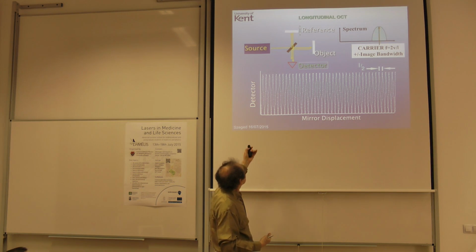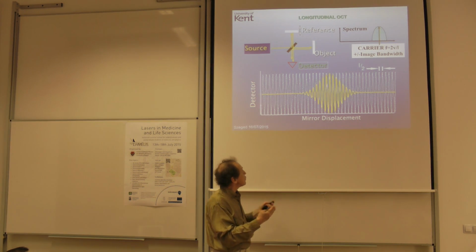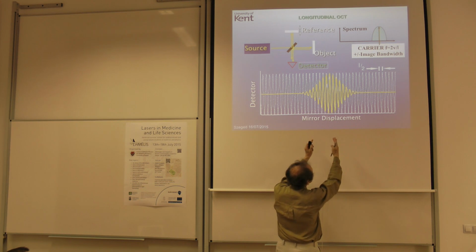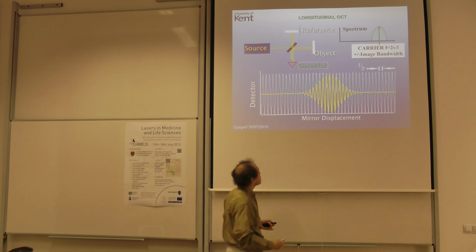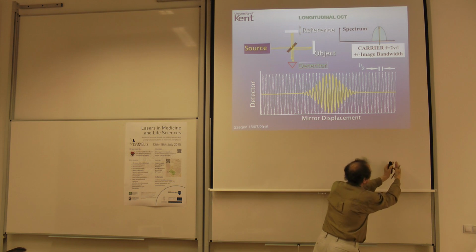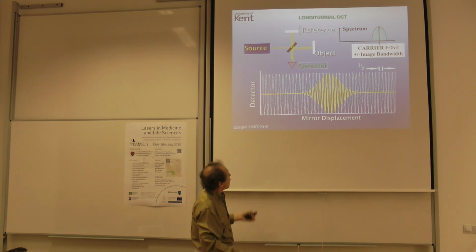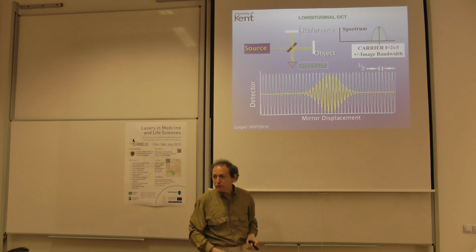So what I need is to replace the laser with a low coherence source, i.e. with a source having a broad bandwidth. And in that case, it is the wave train length which limits the number of peaks here. So now we can practically evaluate the axial resolution of the method. If you do the Fourier transformation of that broad band, you will find that narrow correlation peak, and that corresponds to the extension of this yellow fringe pattern. So out of these many peaks repeated at half wavelength, we have here only, let's say, 10 or 20.